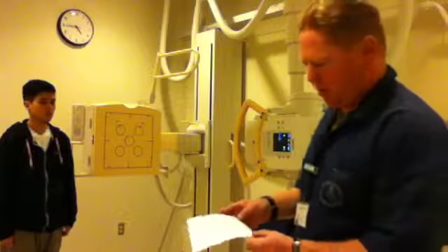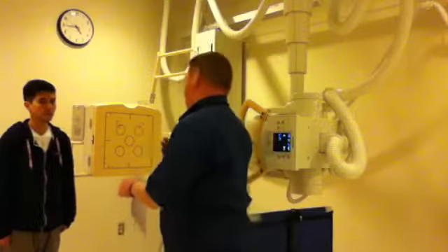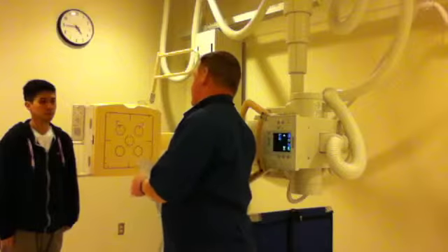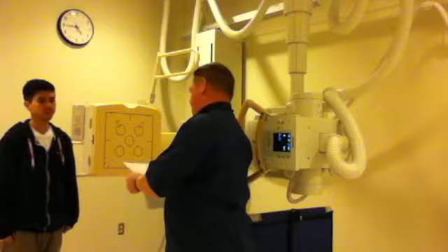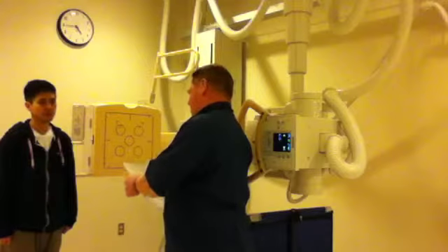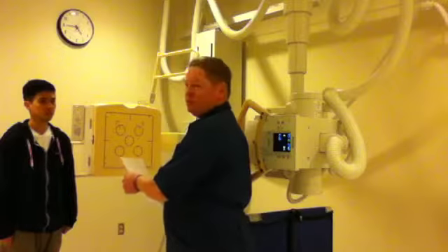So I'm going to go ahead and start with patient ID. Good morning. My name is Stefan. I'm with the radiology department. May I have your full name? Stephen Kimura. And your date of birth? November 6, 1984. Alright.